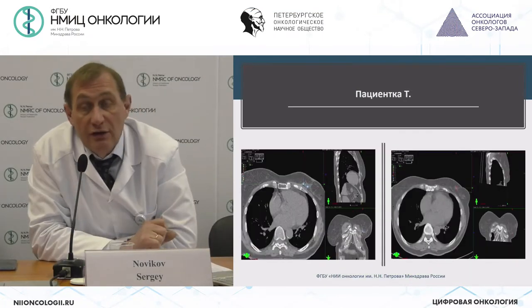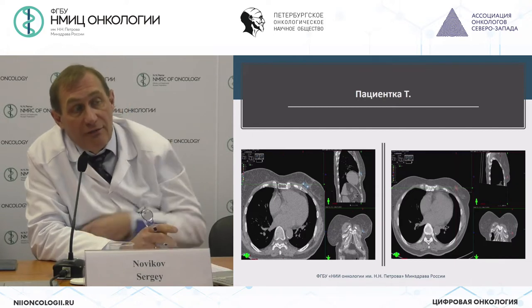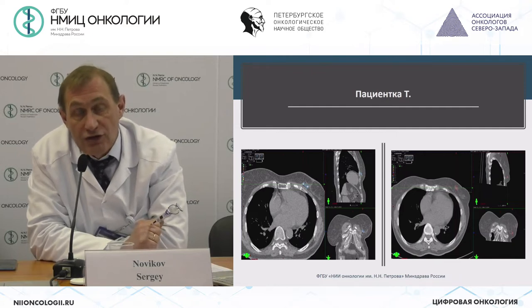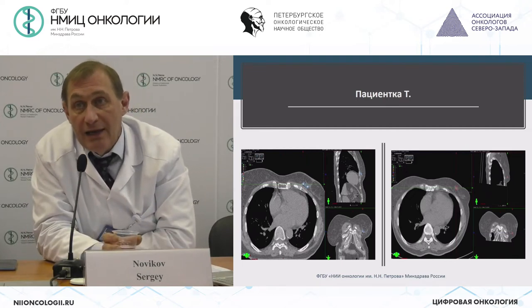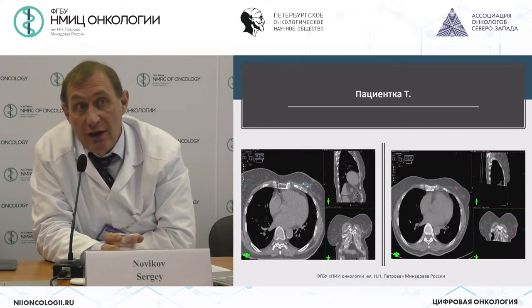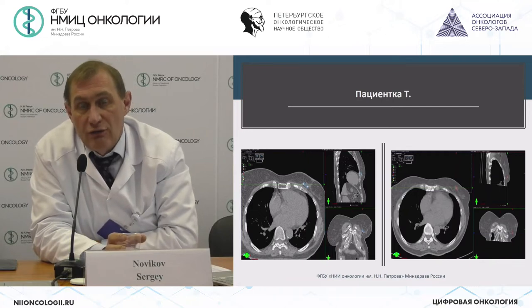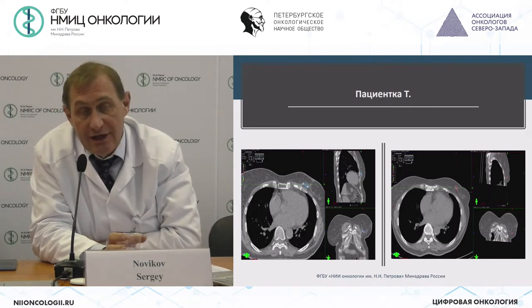But unfortunately, this situation is not an everyday case and not very frequent, because in some cases we have a situation like on this slide. On the left is the patient with clips already. On the right is the CT, which was done before operation. Fortunately, in our everyday practice we have the opportunity to use CT for brachytherapy planning, because all women underwent SPECT CT examinations during staging, and we take this CT from the SPECT CT examinations. We are able to estimate the position of the tumor, and even fuse the preoperative CT with the postoperative CT. Of course, in planning, it is very helpful.